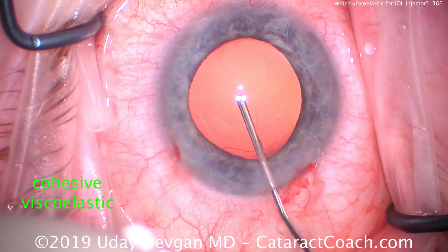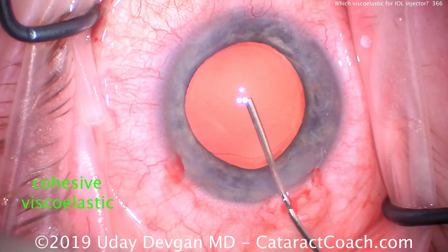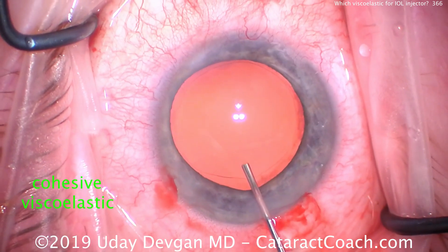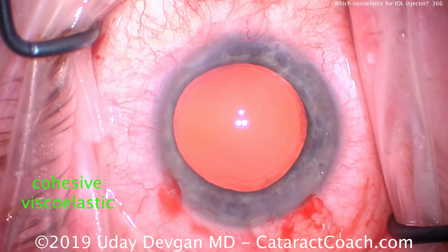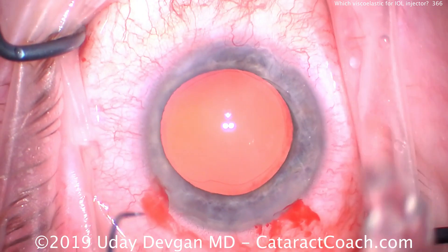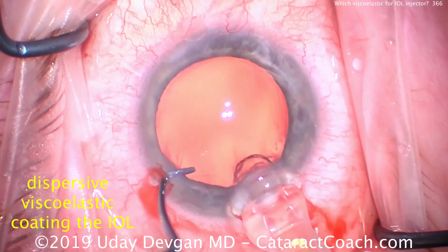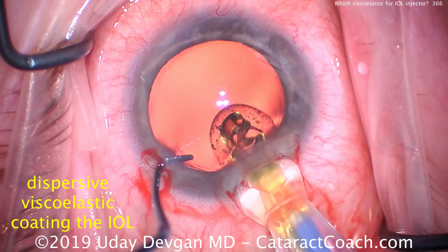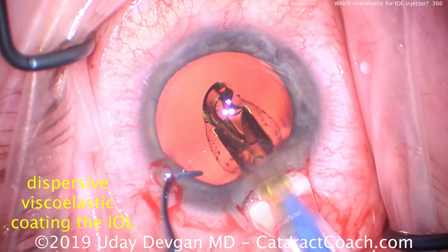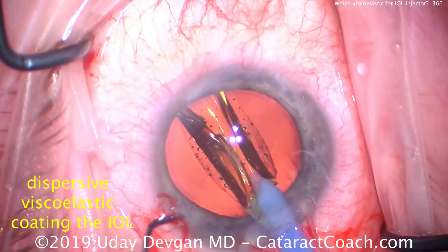Now with an empty capsular bag, here comes our cohesive viscoelastic filling the capsular bag — this is the one that's more solid than liquid. The lens has already been loaded into the injector with a dispersive agent to coat the lens, and you can see the outline of the dispersive agent as it goes inside the eye, which is already filled with the cohesive.